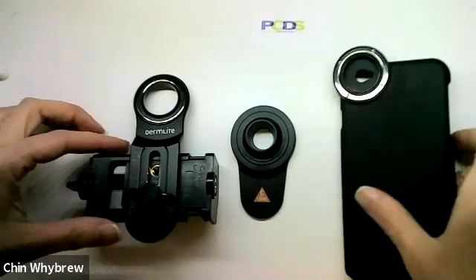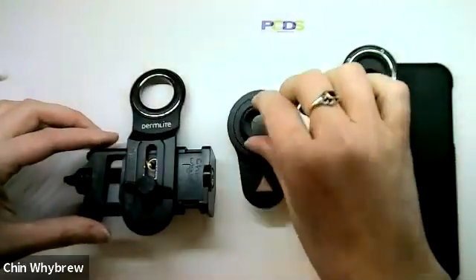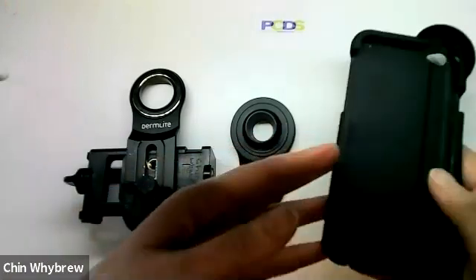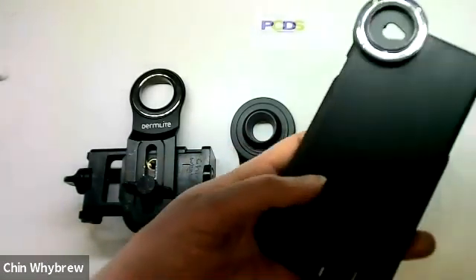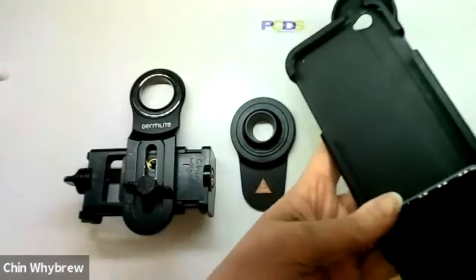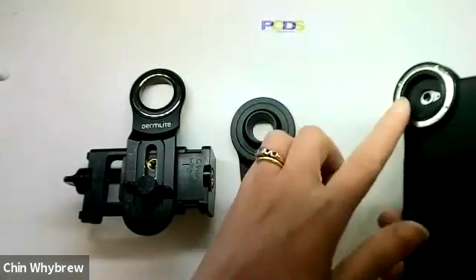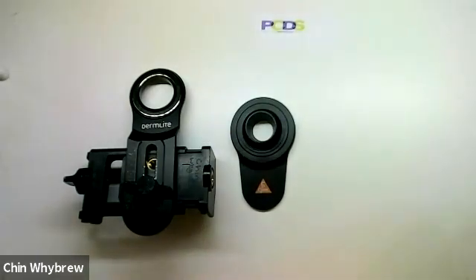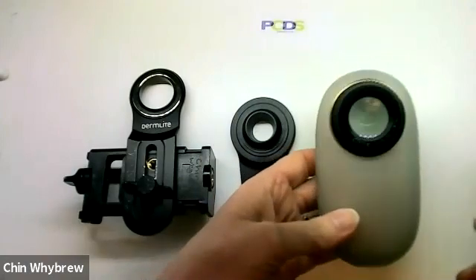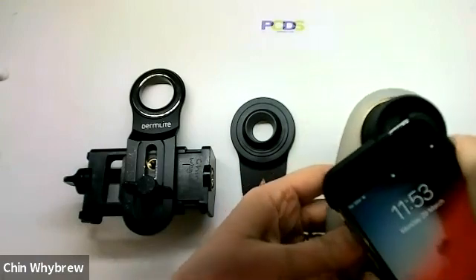These two adapters are both Dermalite adapters, and this is a Heine adapter — these are the three different types of adapter. This one is specific to a standard make and model of phone. In this case it's an iPhone 6, and I can slip the iPhone into the case and it is now perfectly lined up. This magnetic ring will attach to most, if not all, of your dermatoscopes. For example, this one is the Dermalite DL200 — it attaches to that very nicely.